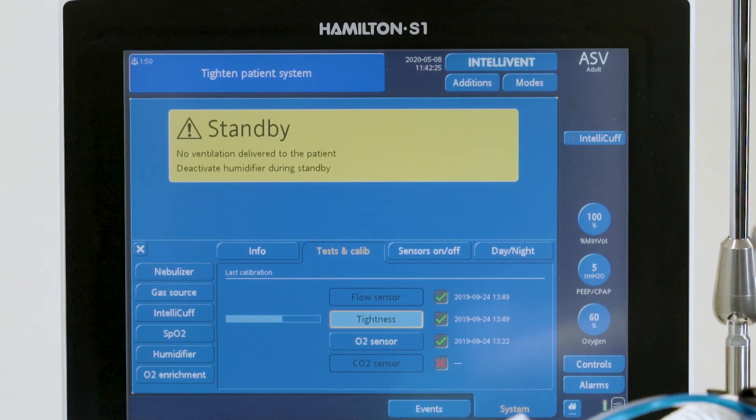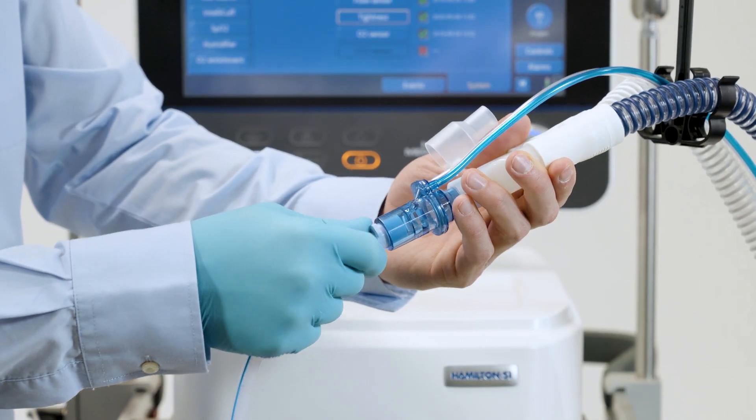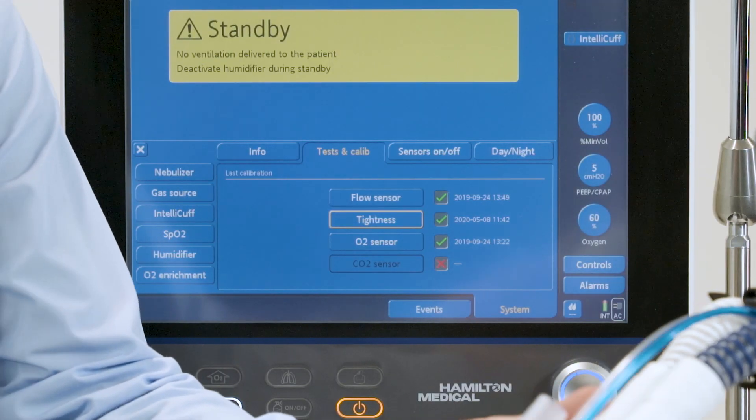After completing the tightness test, the message 'Patient system tight' is displayed. Reconnect the test lung. When the test has been completed successfully, a check mark will appear in the tightness check box.